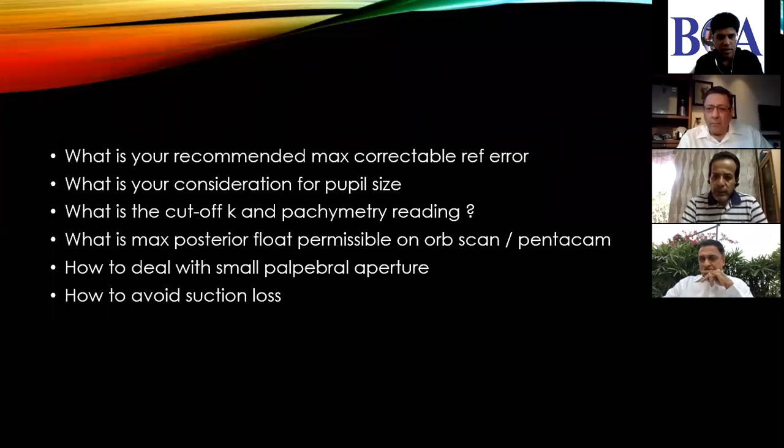So Swapnish, the next. So what is the cut? Yes, sir. To see whether you are a contact lens user, most contact lenses have an optical zone of 6.5 millimeters. So in case the patient did not have glare for night driving with contact lenses, it's unlikely that he's going to have a glare.